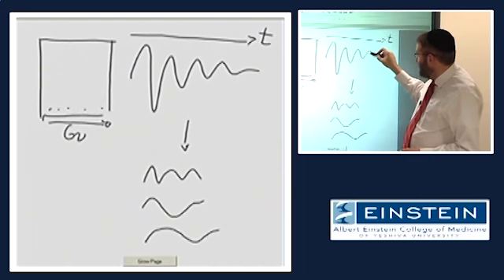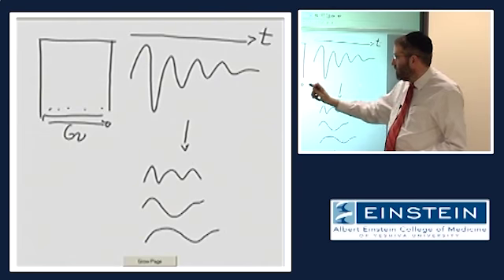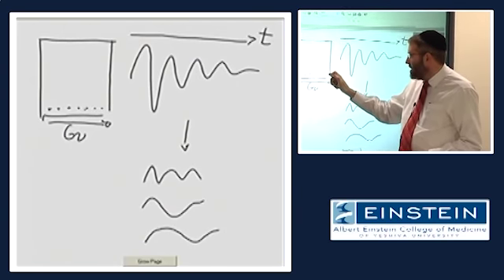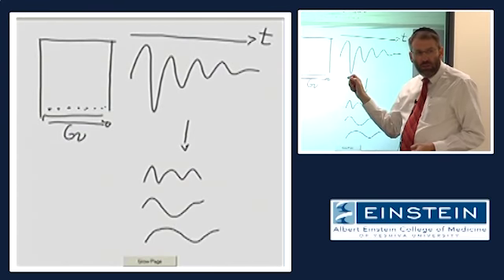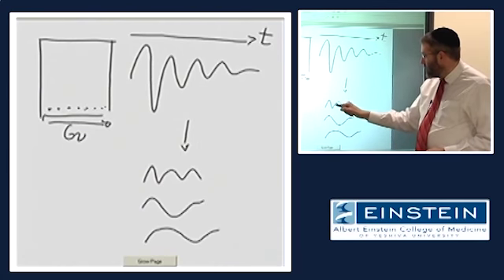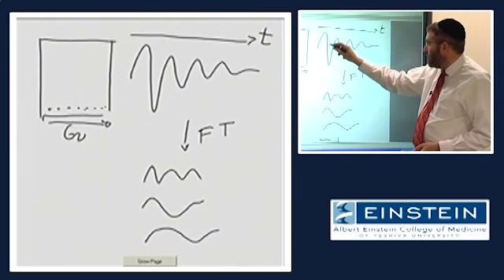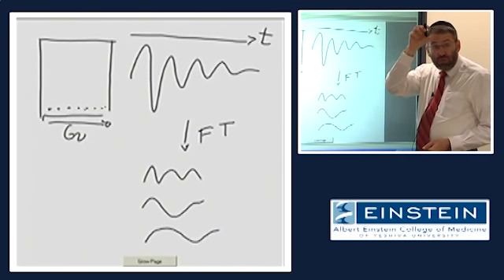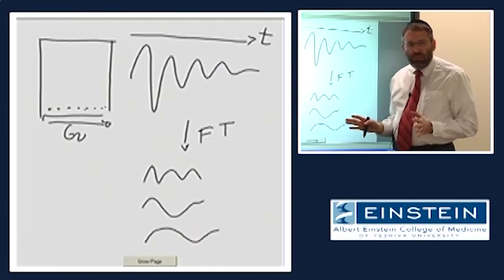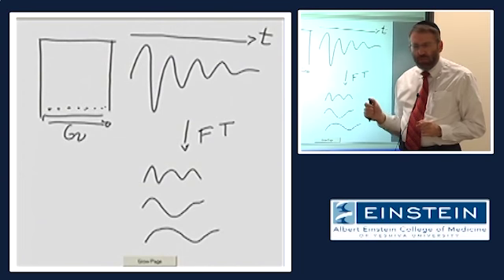The frequencies that add up to give us this signal are frequencies that are being perturbed or changed in a linear fashion along this left-right dimension of the image. And those component frequencies can actually be extracted from this composite by the Fourier transform. Okay? So why don't we stop at this point for maybe 5-10 minutes, and we'll pick this up afterwards.